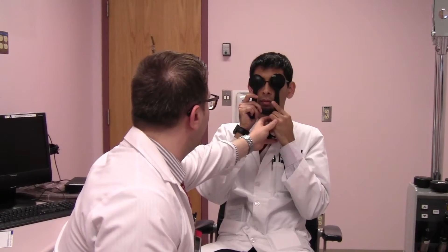Now I'm going to move down one level to see if the patient can read just below the 20-40 line, because we used a staircase approach going up two lines from 20-20 to 20-40. Can you read that line? He says he can't, then guesses R and P but can't see the rest — he incorrectly read the letters. So we'll try another technique: a special device called a pinhole. I'll have him hold it over his right eye and look through the tiny hole while still covering the left eye. He then correctly reads K-O-R-D-H — and that's the accurate way of testing visual acuity with a pinhole.